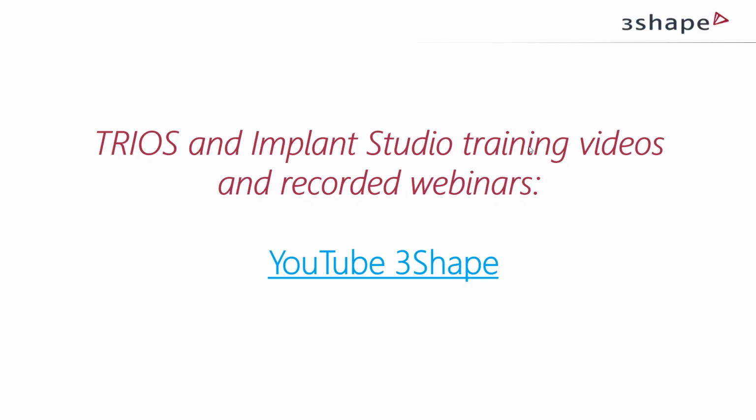Obviously, one of the things that we are seeing is that some of the smaller 3D printers are really starting to pick up, which is very exciting, especially for implant dentistry and guided surgery. And here we see many different brands out there really starting to come with some very low price printers with the right material properties, which is very important when we talk about 3D printing for surgical guides, because we need to have materials with good stability.